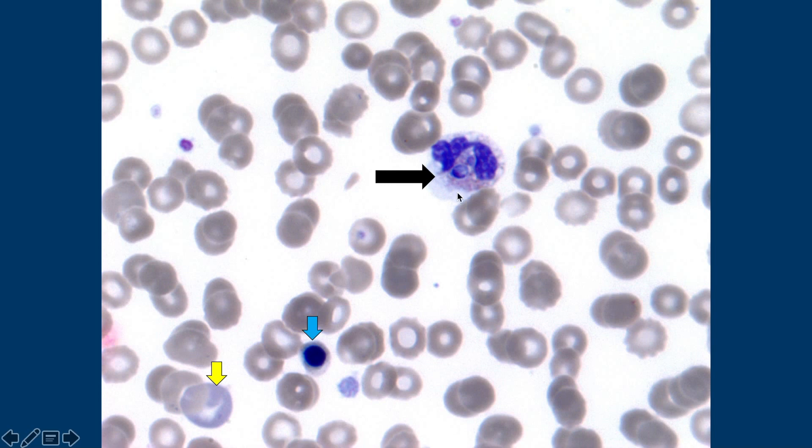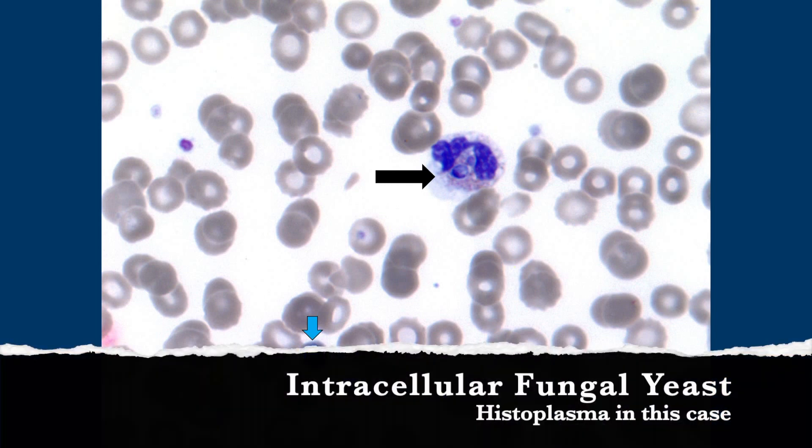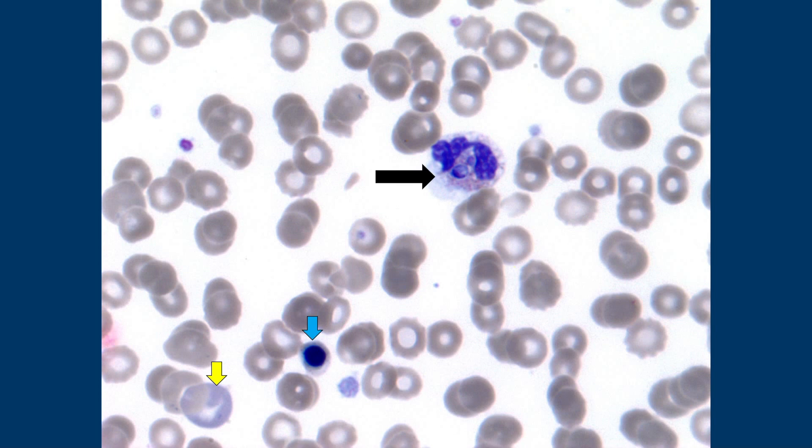That looks like something I should know — it's fungus! It looks a lot different. Is it like histo or something? Because if it's that small, histoplasma is one of the only things I would think of. I don't speciate well on anything, but knowing what's available where I live, when I talk to clinicians I'll tell them I can't say based on morphology, but my gut reaction is that it's probably histo until proven otherwise — but you need to do all the appropriate testing.